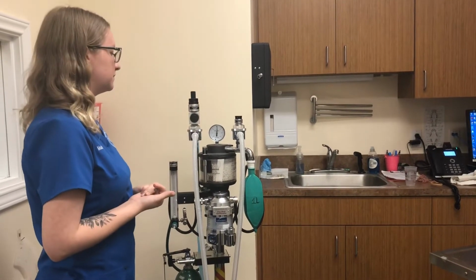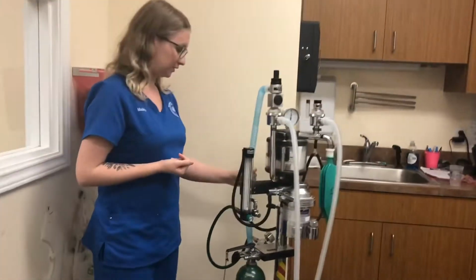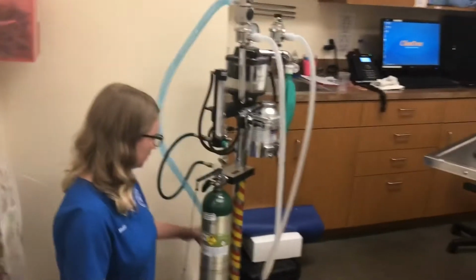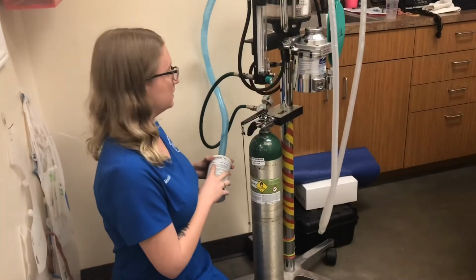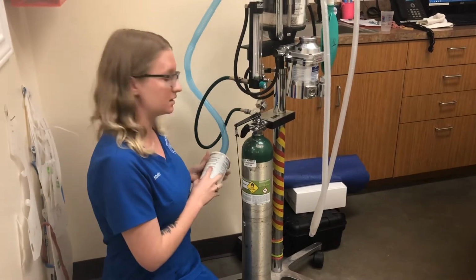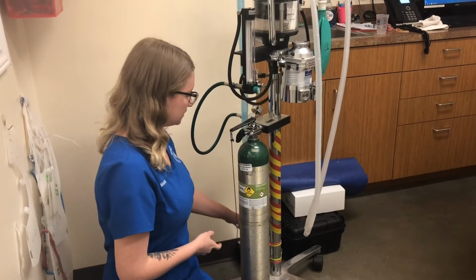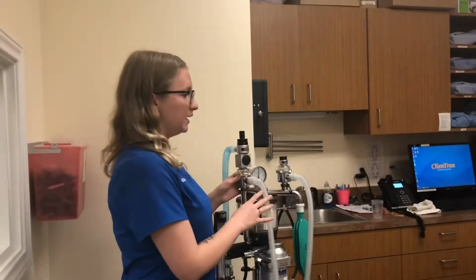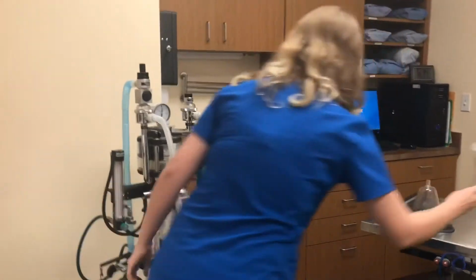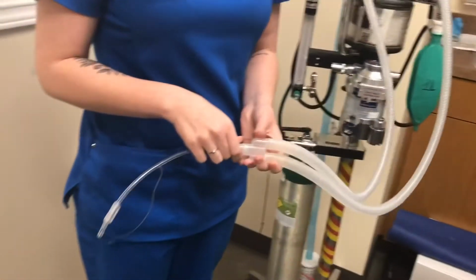Another part of our scavenging system is going back through here. We have an absorbent canister down here, and this will gain 50 grams of weight when it's fully exhausted. That's also taking extra gas that is not being used and is going into the canister. If we are not using an ET tube, which would hook up like this, for whatever reason, we have masks that can hook up instead.